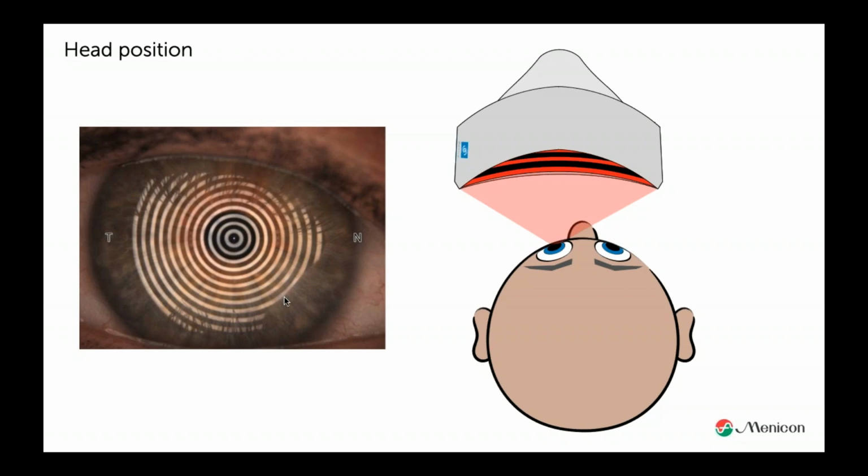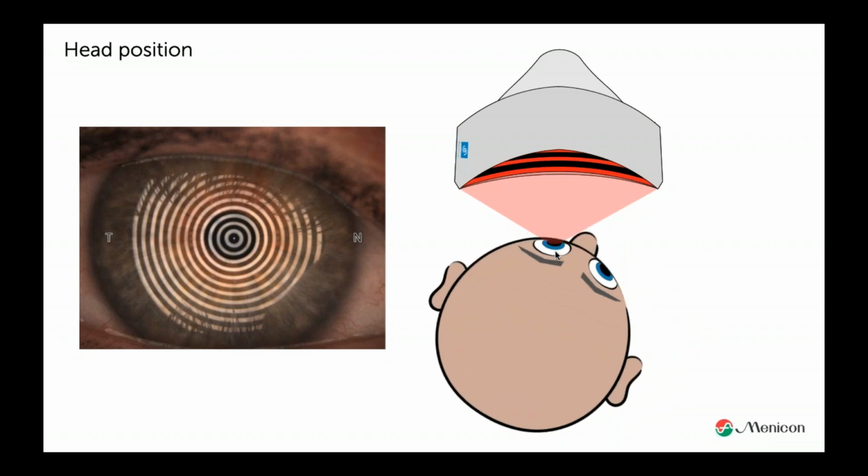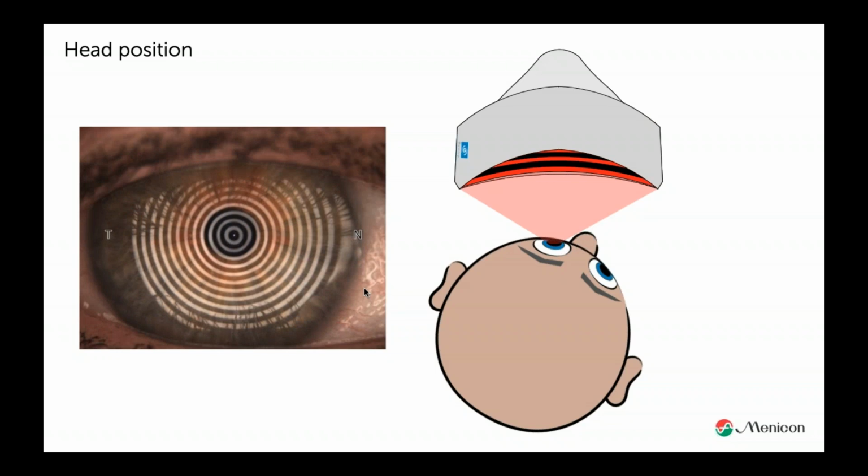And if you don't measure it, you didn't move the head enough. If you want to measure, for instance, the left eye, you have to turn the head to the right side, so the nose is not covering the light bulb anymore, and it will result in a better image. So if I see images where the nose part is missing, I know, okay, the specialist failed. It's not the topographer, it is you as a specialist.